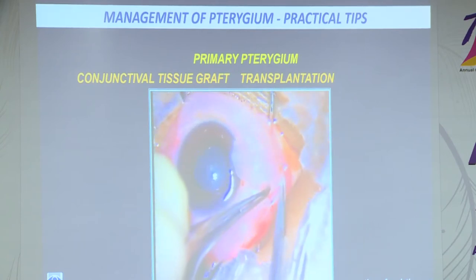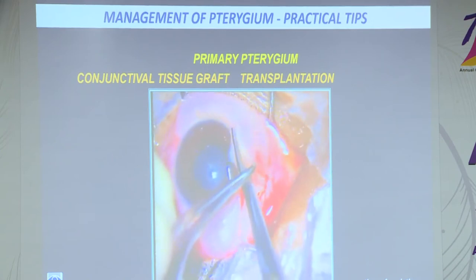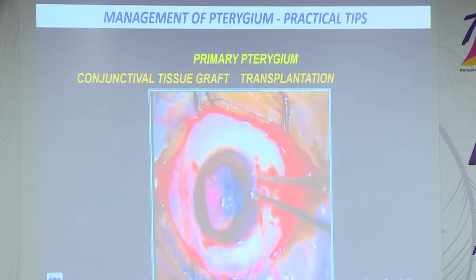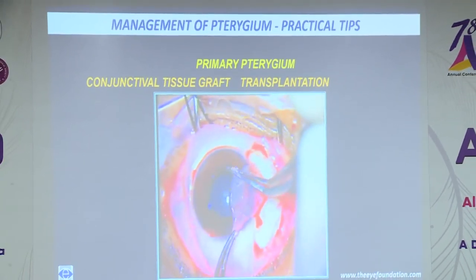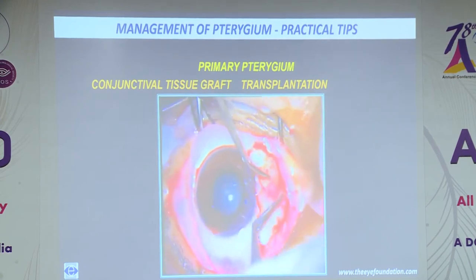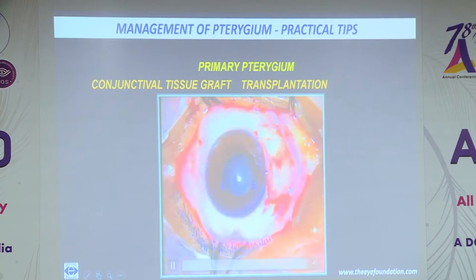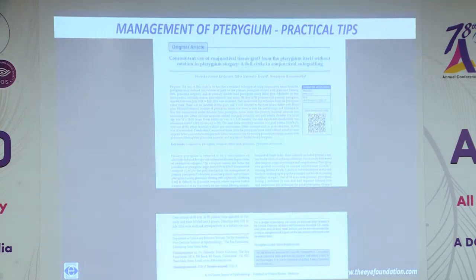I've been trying this procedure for the last 7-8 years with good results. Even though it is a little difficult to obtain a graft from the pterygium tissue, it can be taken. It is actually thick compared to the normal conjunctiva. It may be around 8 to 12 layers of thickness compared to the 4 to 5 layers of normal conjunctival thickness, and can be placed on the bare scleral bed and either sutured or glued.